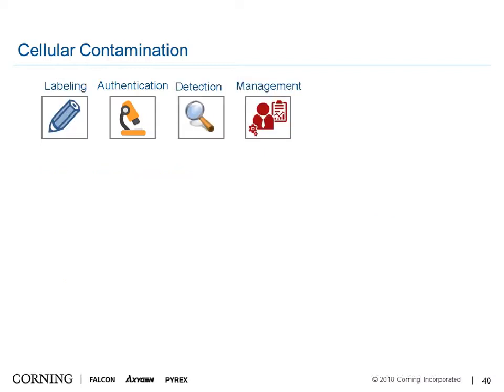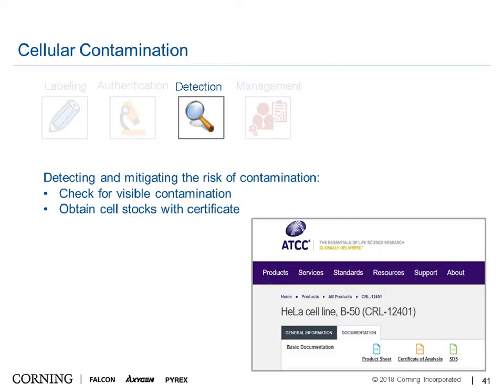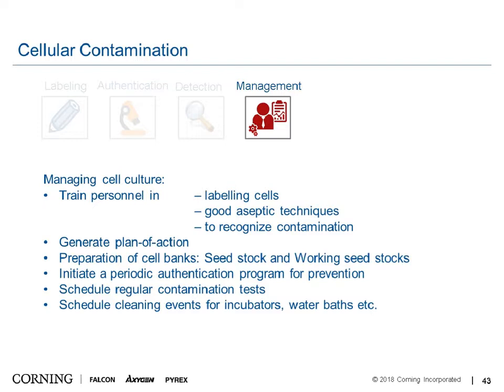To detect cellular contamination, the easiest approach is to check cells under a microscope and look for cell lines that appear unusual. Obtaining cell stocks with a certificate of analysis — for example, from ATCC when buying a HeLa cell line — is also helpful, as these certificates state how the cell line was tested and what its characteristics are.